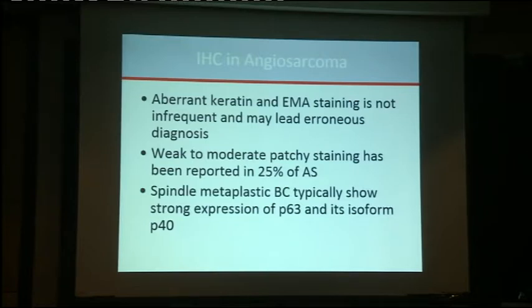That was the case in our core biopsy. And weak and moderate patchy staining has been reported in up to 25% of angiosarcomas. So one focal keratin positivity does not make it into carcinoma. When we are evaluating the high-grade spindle cell lesions of the breast, we are thinking of spindle metaplastic carcinoma, and they also can show focal keratin positivity.